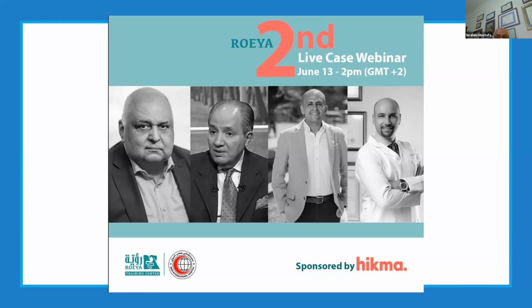The last one, which I think is a very important question: if Hani removes the stent and the stricture is still present, what will you do? Do you go to surgery or use a restent?